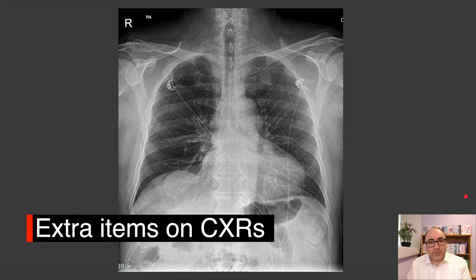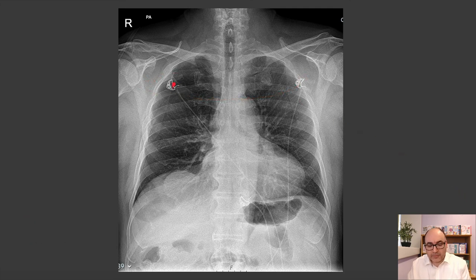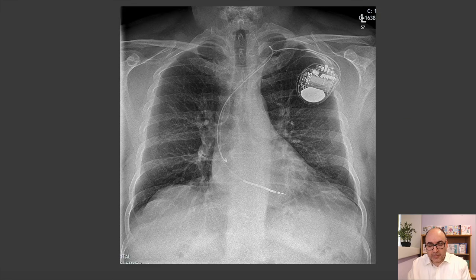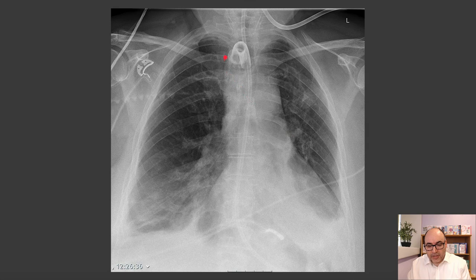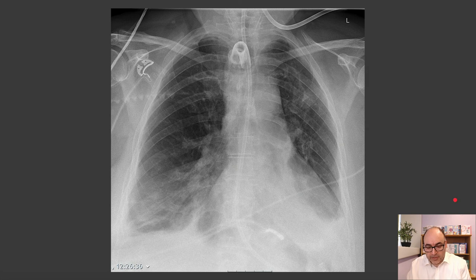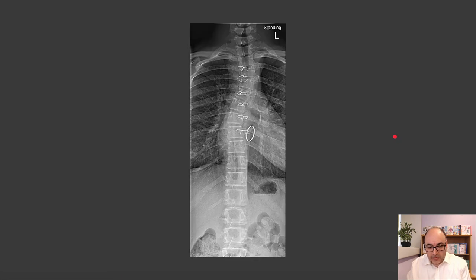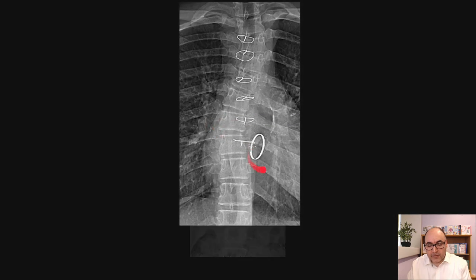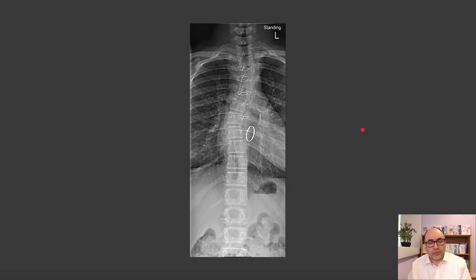A few common devices visible on x-rays: ECG leads with connecting wires; a pacemaker, which appears very bright due to its metal components; a tracheostomy tube; an NG tube — confirmed in the correct gastric position because it's below the diaphragm, and you can also aspirate acidic gastric content to verify placement. This patient has had a valve replacement — the prosthetic valve is very white and dense — along with sternotomy suture wires used to close the sternum, and a visible scoliosis in the vertebrae.